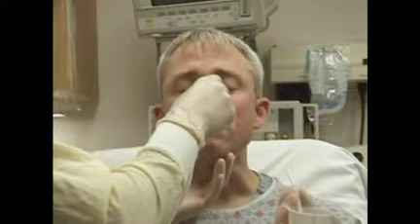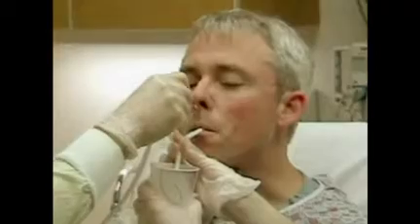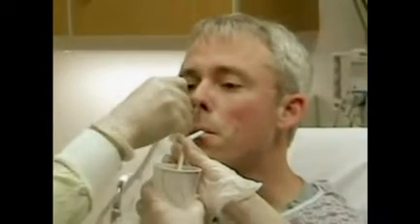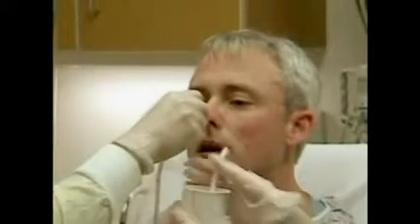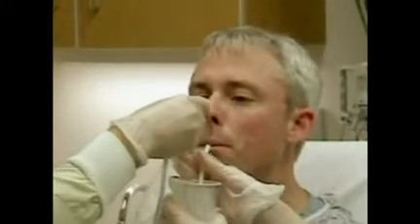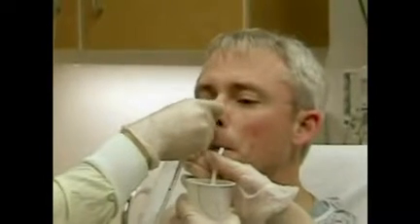The patient may gag once the tube reaches the larynx. Temporarily halt the advancement of the tube and ask the patient to begin swallowing sips of water through a straw. Coordinating advancement of the tube with the swallowing mechanism facilitates passage of the NG tube into the esophagus and prevents entry into the trachea. This is a fluoroscopic view of a nasogastric tube being inserted.